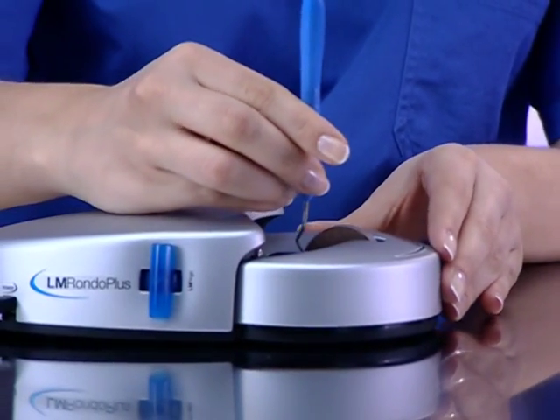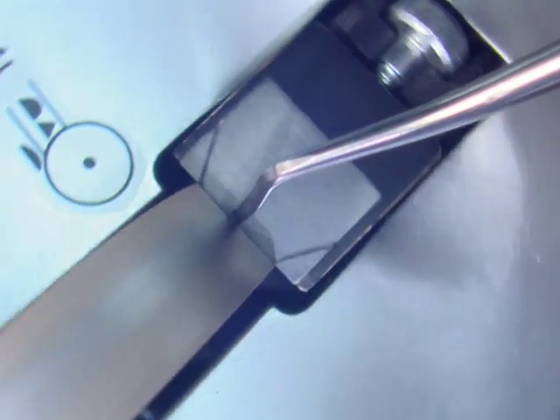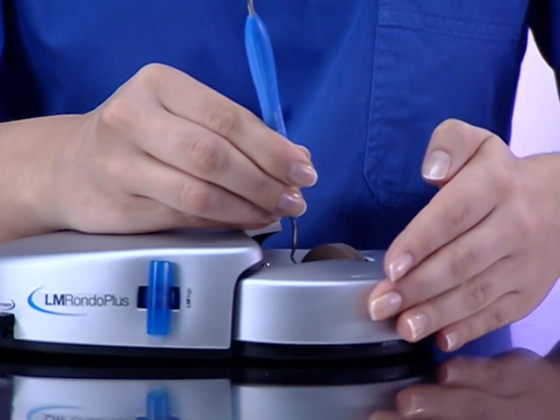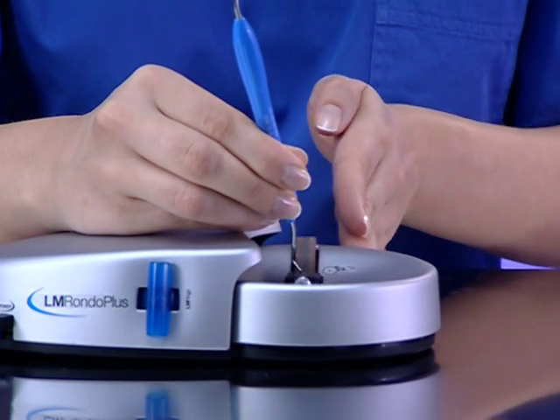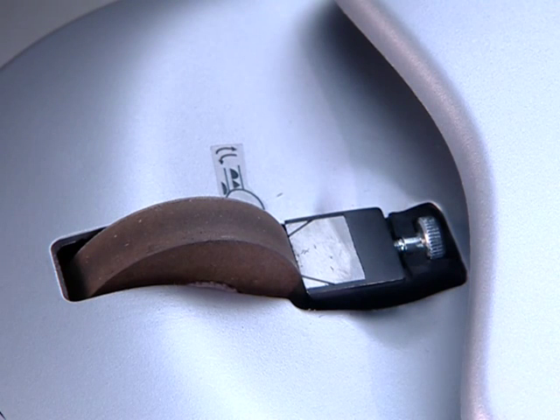The LM Rondo Plus sharpening method is simple. The instrument is held in place with one hand, while the sharpening stone is rotated around the blade with the other. The hand holding the instrument rests comfortably on a handrest. Rondo Plus comes with a fine 400 grit ceramic sharpening stone. You can also order finer and coarser grit sharpening stones.